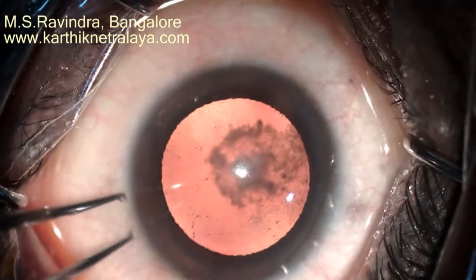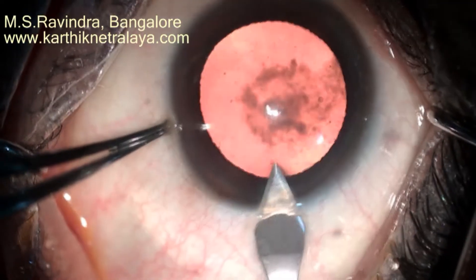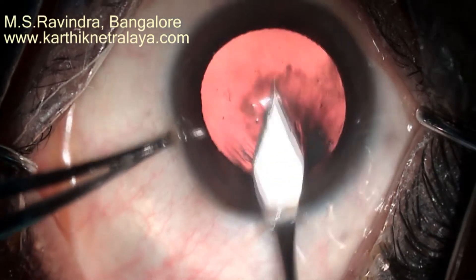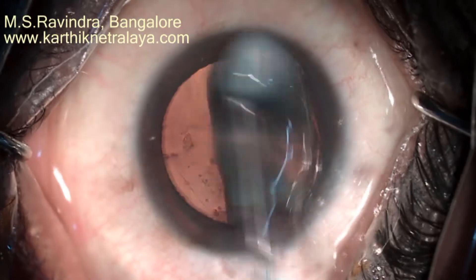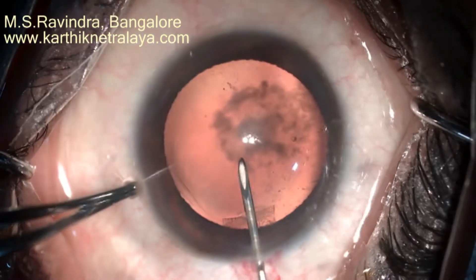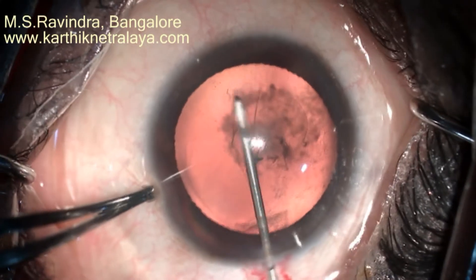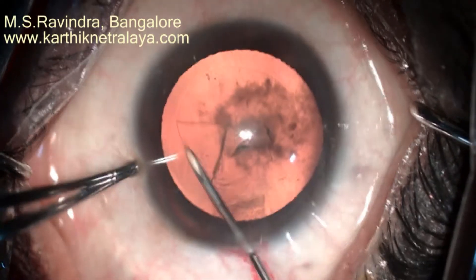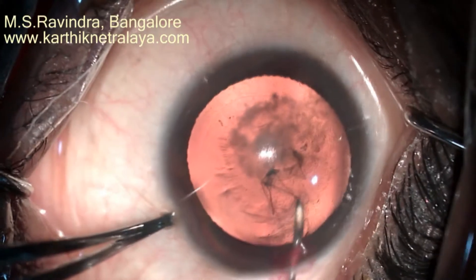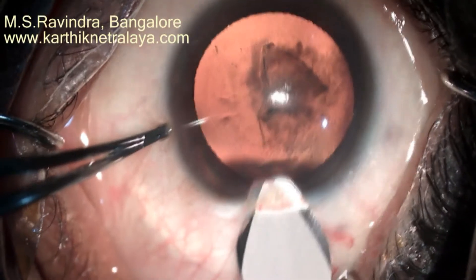A posterior subcapsular cataract: a keratome entry is made through the limbus and the cornea under topical anesthesia. The AC is filled with viscoelastic. A tunnel floor entry method uses a cystitome to create capsulorhexis through a stable entry chamber. The chamber is deep because it's filled with viscoelastic; visibility is very good with no wrinkles in the cornea, even in the proximal zone where the tunnel is made, because entry is through the floor of the tunnel. The AC is deep and accessibility to the periphery is extremely good.